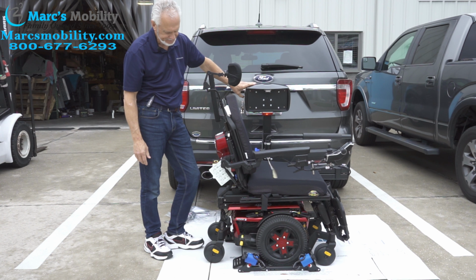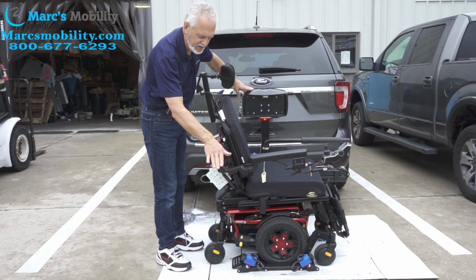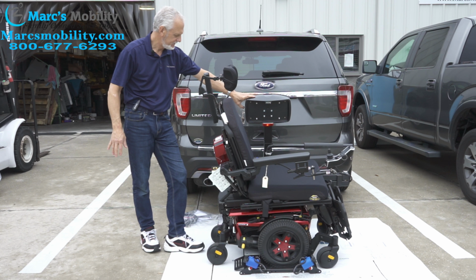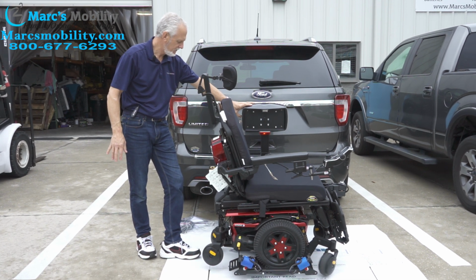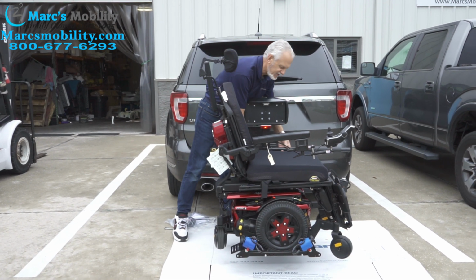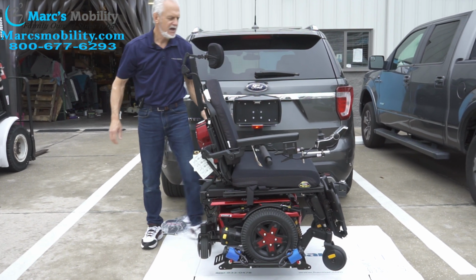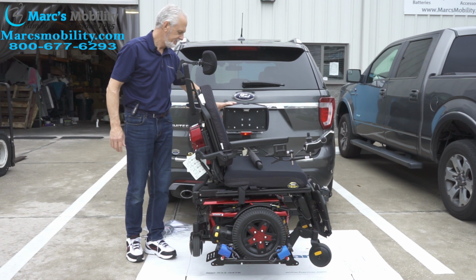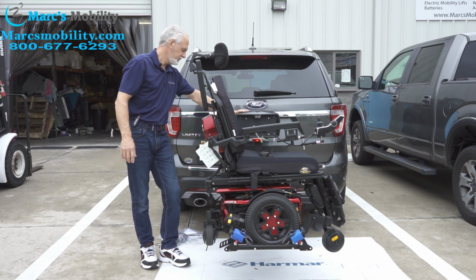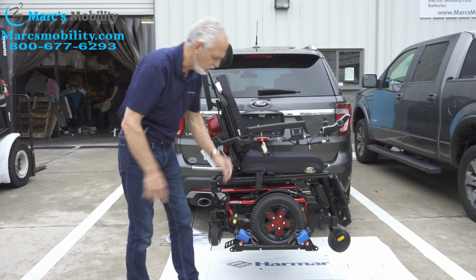So we're going to go up. And when you go up, the platform will be tilted this way, and then it'll tilt back up as you go halfway up there. Now as you're raising the lift up, you have this secure bar right here that you need to put over the seat. This bar right here, that's your first securement. So you have the bar on the seat already here, and this bar needs to be adjusted, okay?